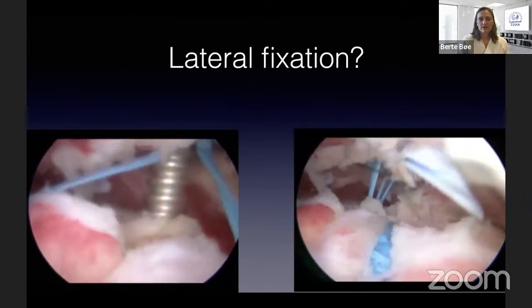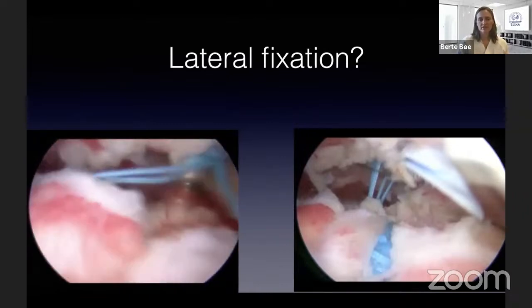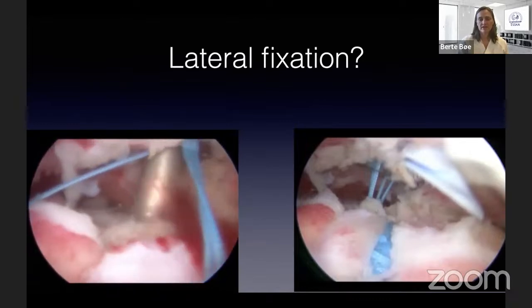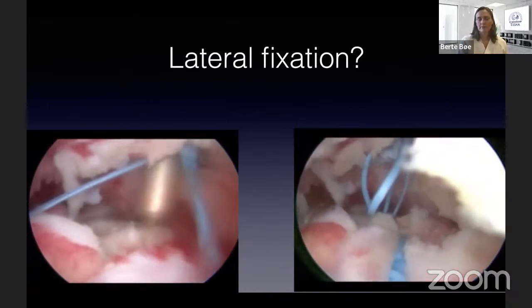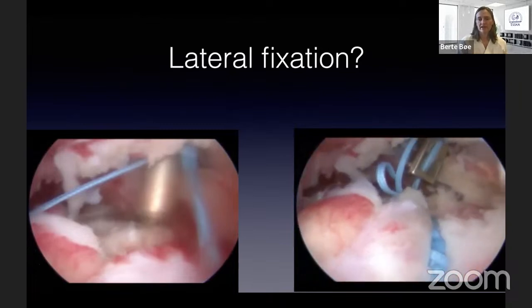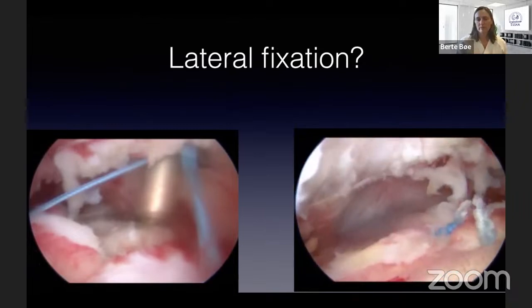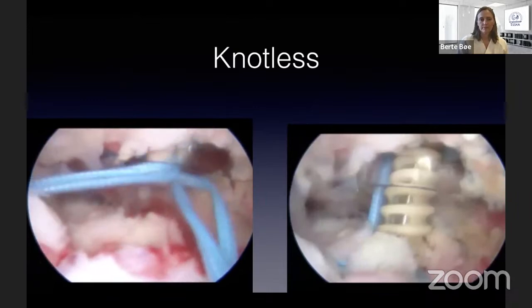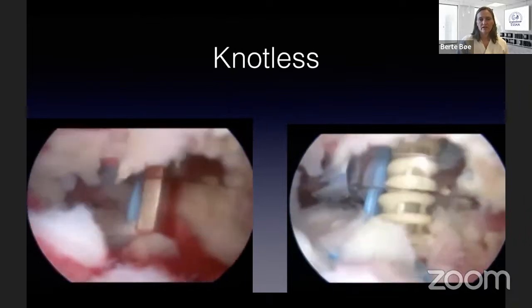And then there's the question if you will need a lateral fixation. Well, in this case, I decided to do that, but I have to admit that the evidence is not that convincing that I always do a double row. So just when I think it's needed, or especially if it's a huge rupture or if it's a reoperation. For small supraspinatus tear, I often do a single row. And this is just fixation of the lateral row.